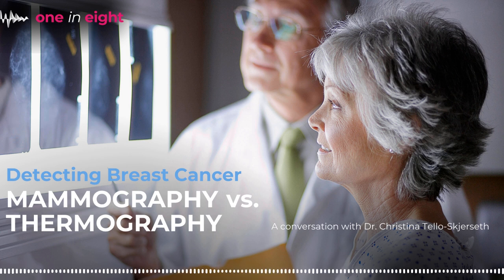So I guess to summarize, the main issues with mammography are the radiation, the pain. Another one is the callback rate, meaning if you have a screening mammogram and then we find something and bring you back for more imaging, people get very anxious and concerned about that. But what people need to realize is that there's really only a 10% callback rate. So for every 1,000 mammograms that we read, we're only really calling back 100 people to get further imaging. And the vast majority of those people will just get sent back to screening or have a short-term follow-up.